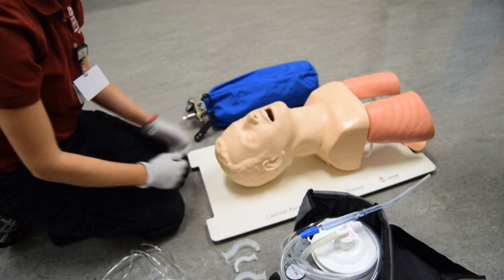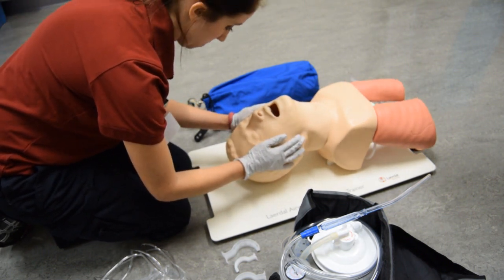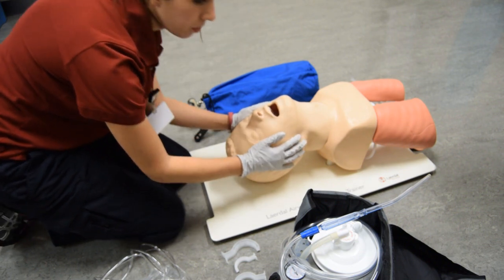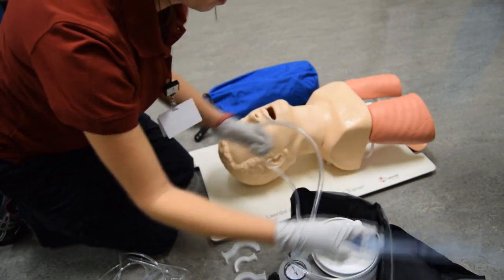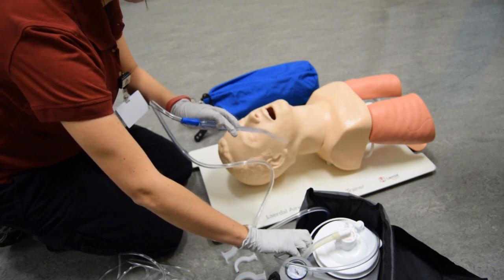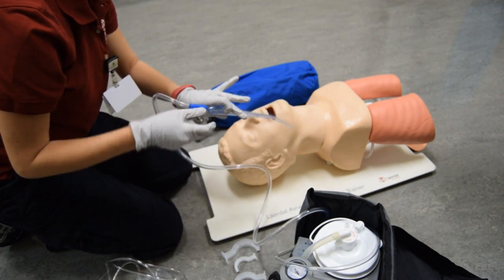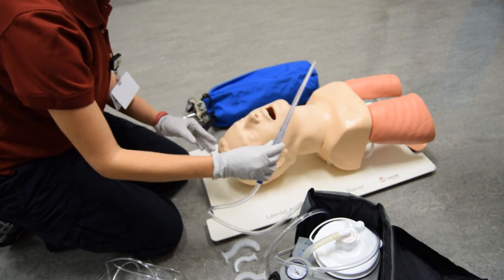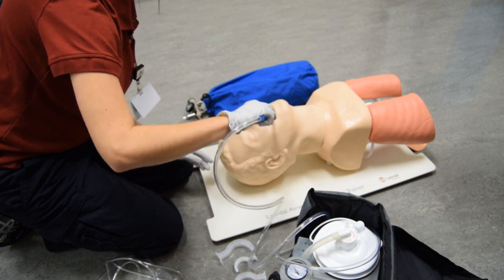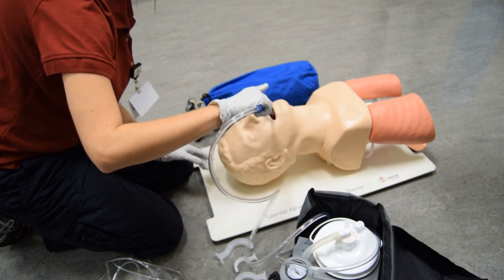Now the student must open the airway properly. The examiner now informs the candidate the mouth is full of secretions and vomitus. Prepares rigid suction catheter. Turns on power to suction device or retrieves manual suction device. Inserts rigid suction catheter without applying suction. Suctions the mouth and oropharynx.